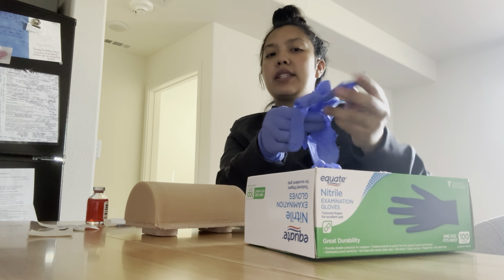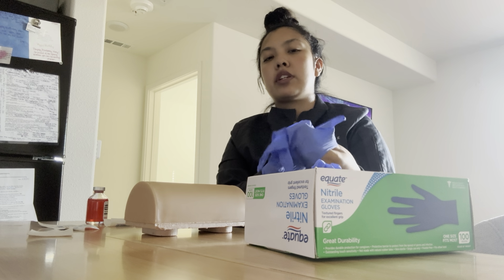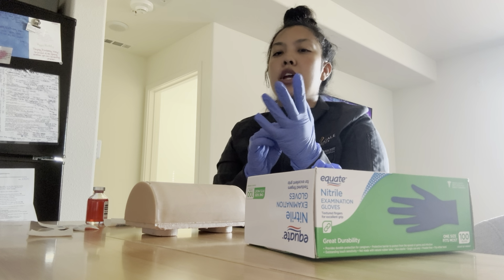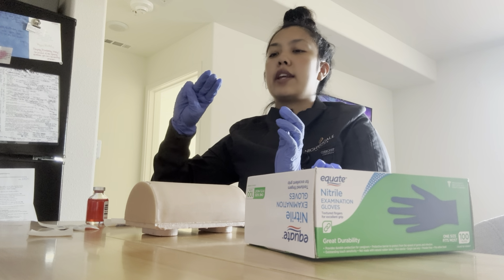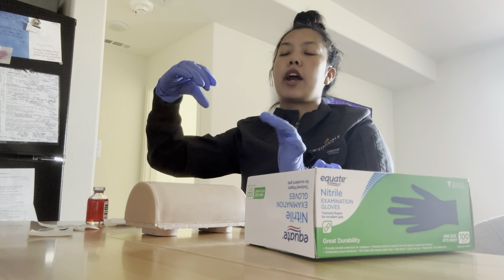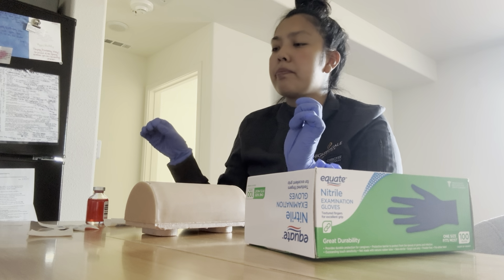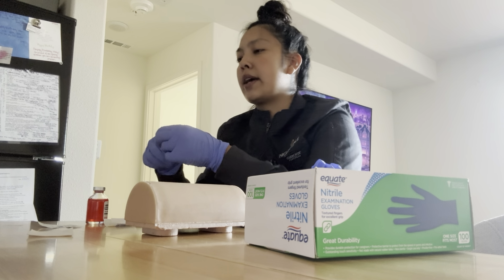We have a couple of places that this can go. This can go ventral gluteal, or this can go in your arm. Do you prefer the arm? Okay, perfect. So I'm going to be going on your acromion process. I'm going to be going 3 fingers down from the acromion process, making sure I have the deltoid muscle, going in at a 90-degree angle.